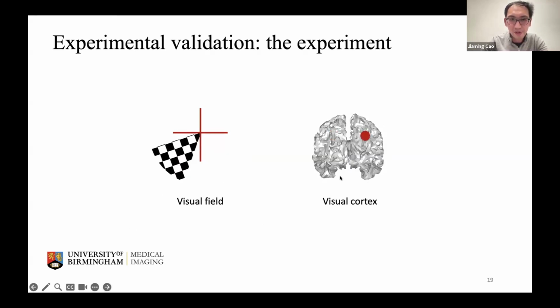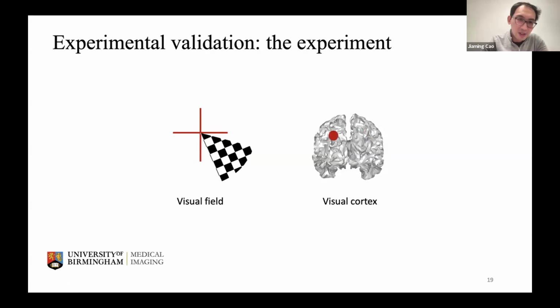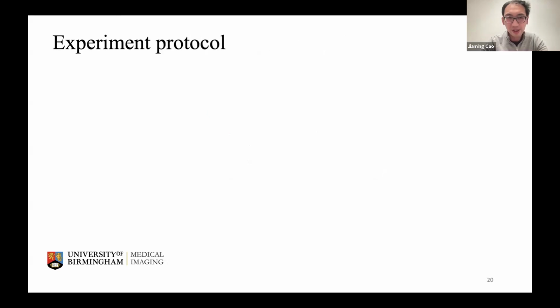And if I rotate between these two things at a fairly high speed, then DOT itself will not be able to tell apart when is which happening. And EEG, of course, will be able to tell them apart, but with the blurriness it is not going to be spatially very accurate. The hope is that if we apply the DOT reconstruction as the spatial prior for EEG, we can not only resolve these two different locations of stimuli, we can also make them spatially more confined. So that's the idea.